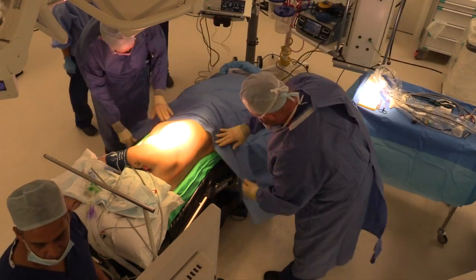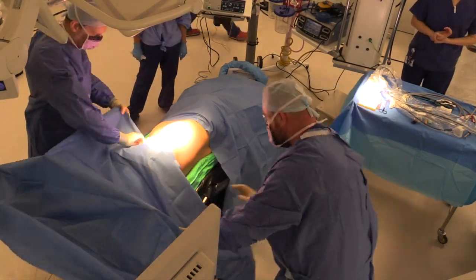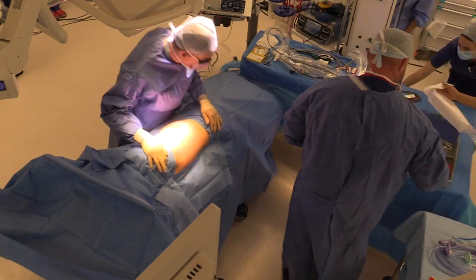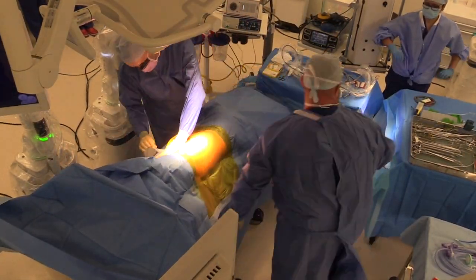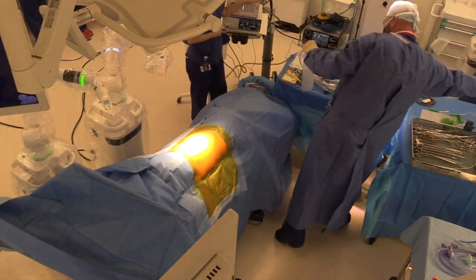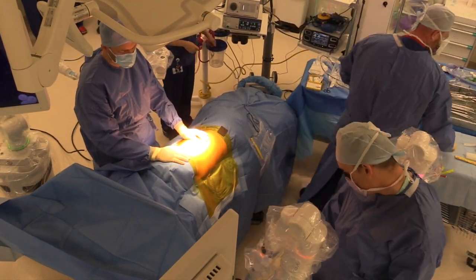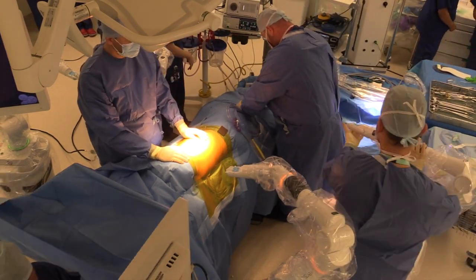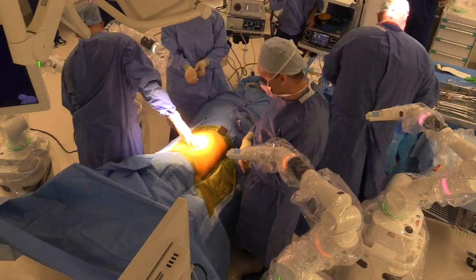We're going to show you how they do this completely endoscopic Versus technique. We break the bed for this right upper lobectomy, a little bit head up. Even though I've sped it up a little bit, I want to get across how quick and easy it is to set up this robot. The very small bedside units — myself, Adam, and the team — are just bringing them up into view, angling them in readiness for the first incisions. We've got four: three arms and one endoscopic unit.